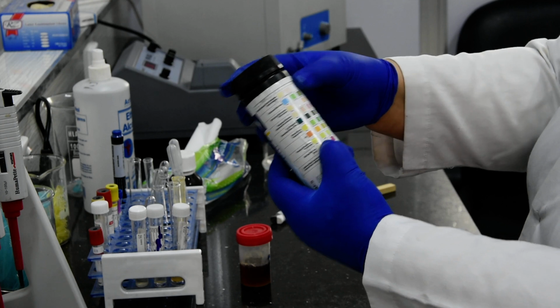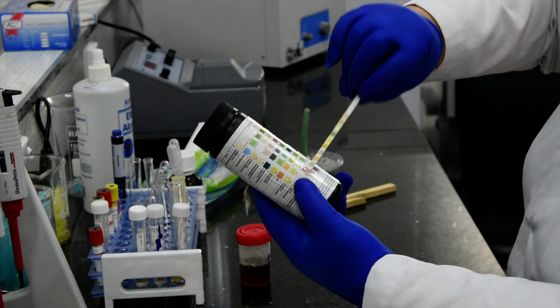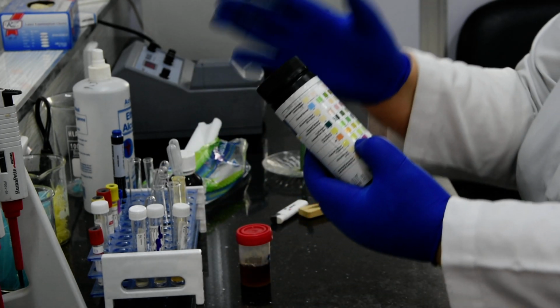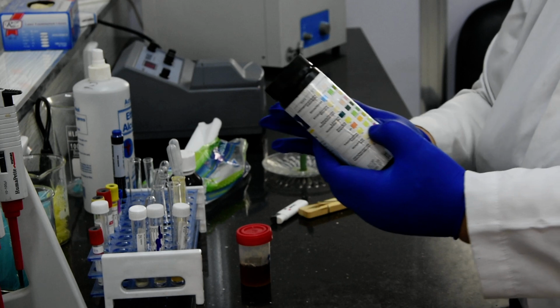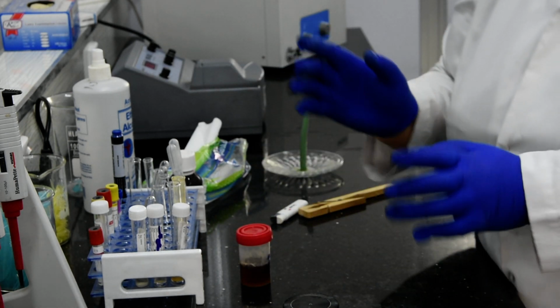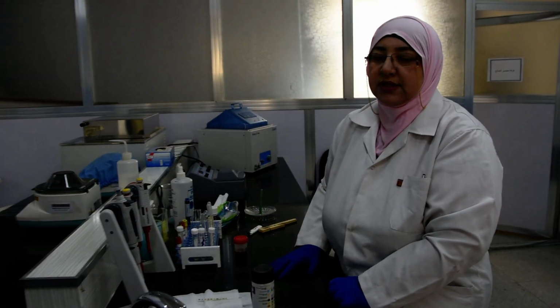You see this, when we compare the chart with it, we can tell the doctor if we have negative or +1, +2, +3, and at the last +4. This method is to detect if our urine has protein or not. That's it.